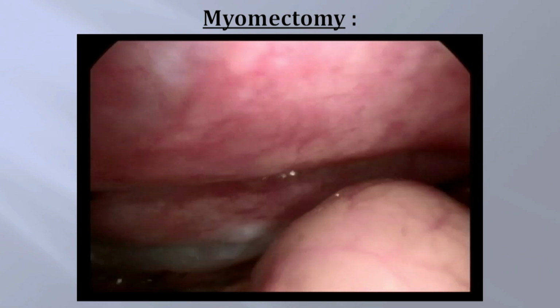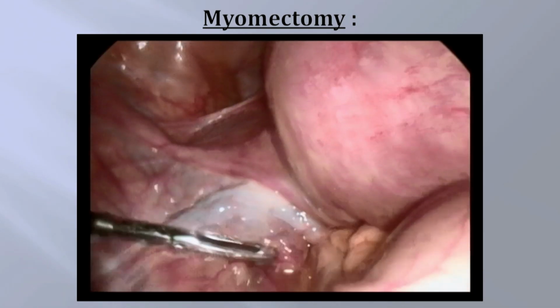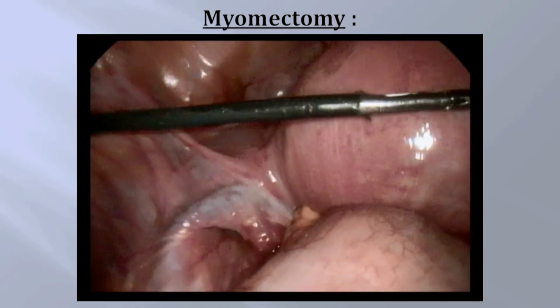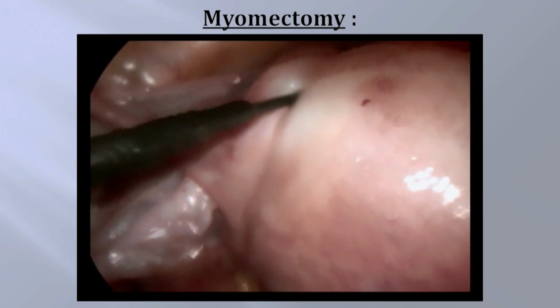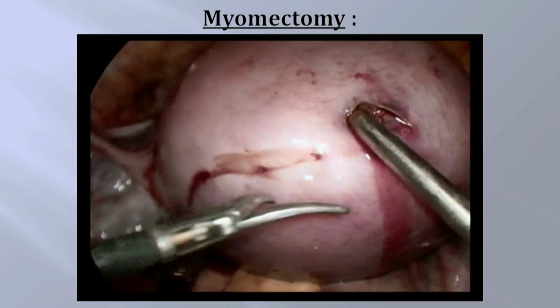Then moving on to fibroids. Obviously, as shown, there are different kinds of fibroids: intramural, submucosal fibroids. This is a serous fibroid which is anterior wall. We do it with vasopressin. We inject 20 units of vasopressin diluted into 200 ml normal saline.